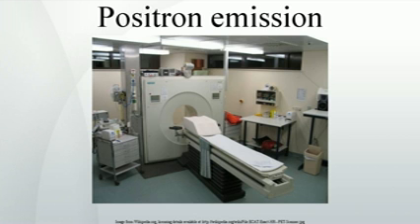PMP, N-methylpiperidin-4-yl propionate, is a novel radiopharmaceutical used in PET imaging to determine the activity of the acetylcholinergic neurotransmitter system by acting as a substrate for acetylcholinesterase. Post-mortem examination of AD patients has shown decreased levels of acetylcholinesterase. PMP is used to map the acetylcholinesterase activity in the brain, which could allow for pre-mortem diagnosis of AD and help to monitor AD treatments. Avid Radiopharmaceuticals of Philadelphia has developed a compound called 18F-AV45 that uses the longer-lasting radionuclide fluorine-18 to detect amyloid plaques using PET scans.